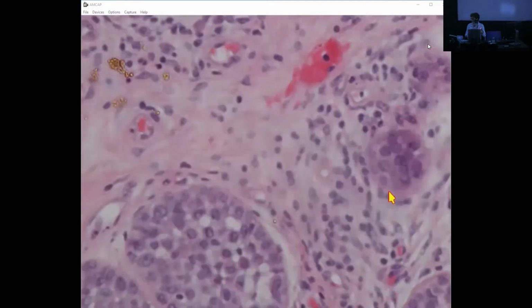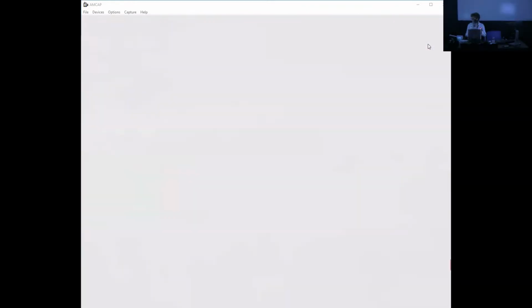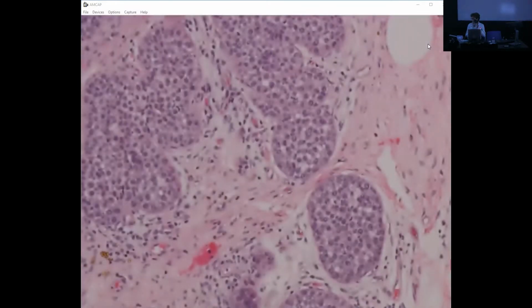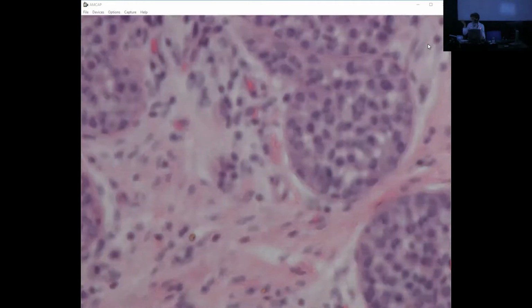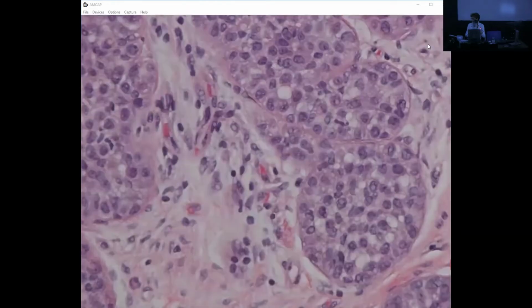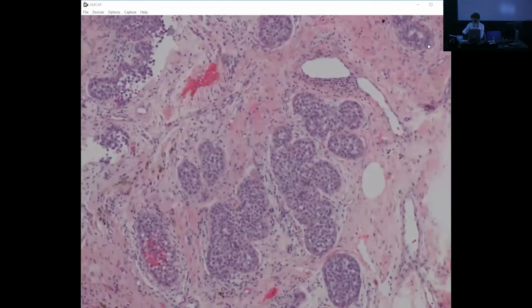But all these, again, you find three cell types. Here is another cell with that vertical orientation, another nucleus, probably a myoepithelial cell. So I always look for myoepithelial cells in the middle of this proliferation to support the diagnosis of lobular neoplasia, in contrast to a case of solid proliferation of ductal nature. So here there are no other specific findings, just a typical morphology. Here is another case.